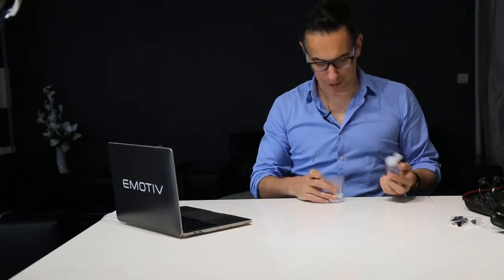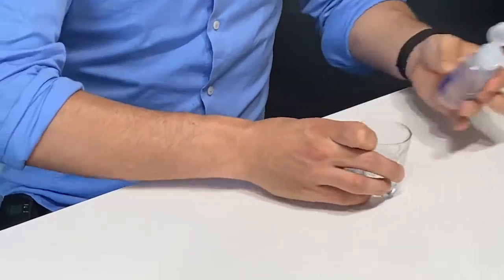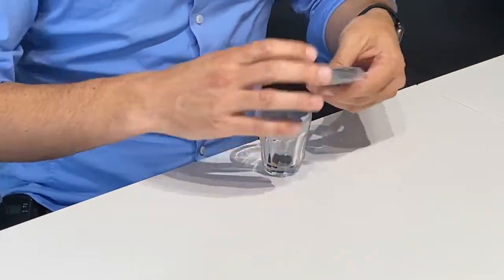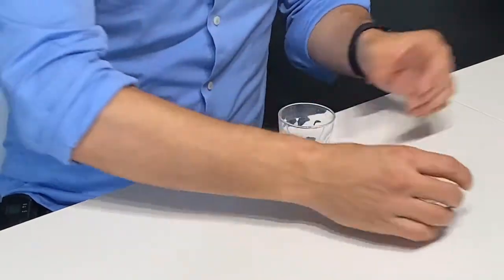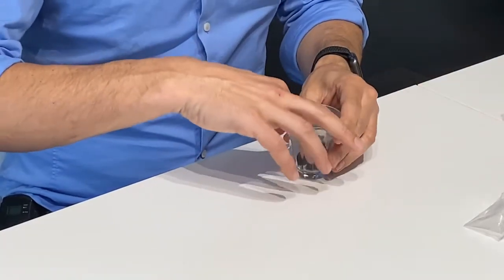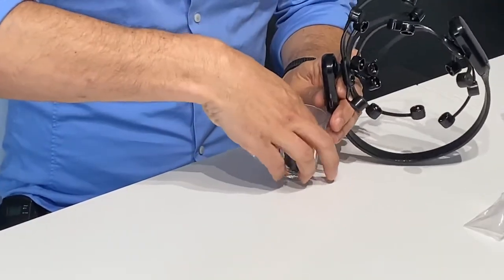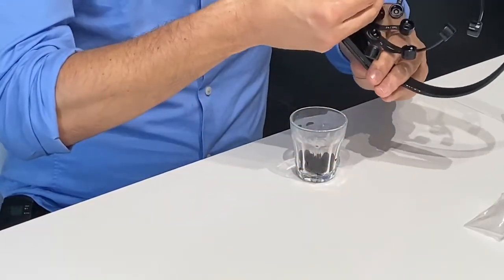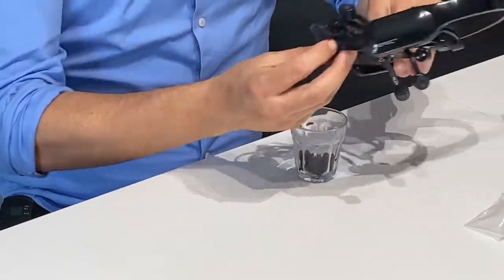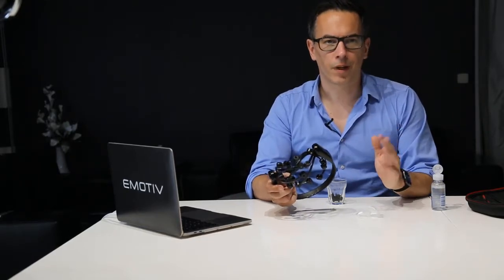Here is my little hack prior to running the experiment. Generally what I do is I put the liquid in a little glass and then I put all the foam pads in the glass so that they all get soaking wet before I start the experiment. Once they are totally wet, I get the brainware and put them in. This is a little solution that I started to use years ago and it's always been great and very helpful.